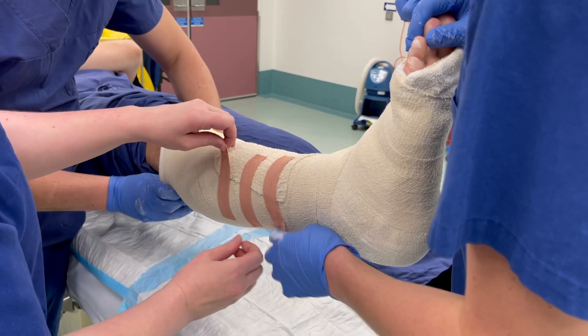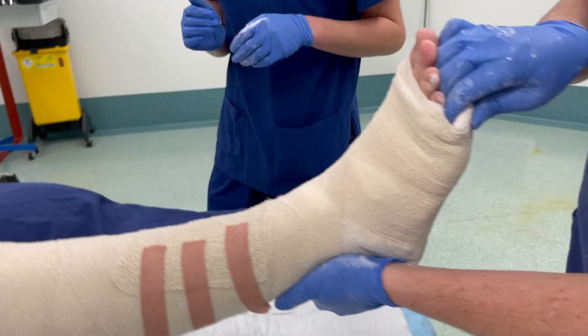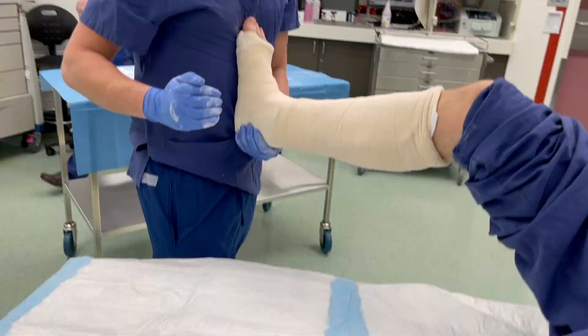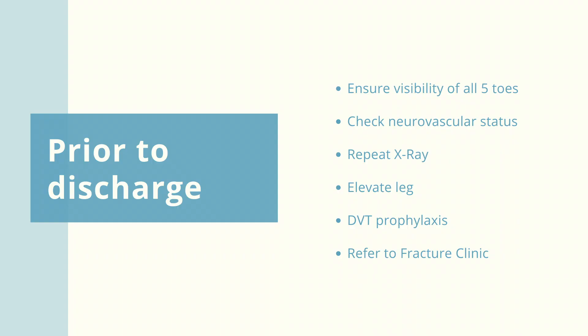While the plaster is setting we continue to flex the knee and rest the patient's ankle onto the applicator's torso at 90 degrees. At completion of plaster application, ensure all five toes are visible and that the patient has free range of motion at the knee joint.